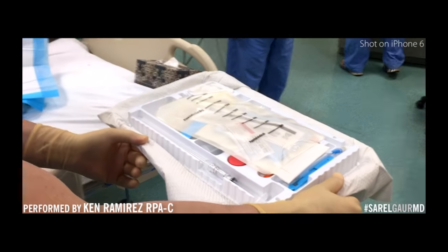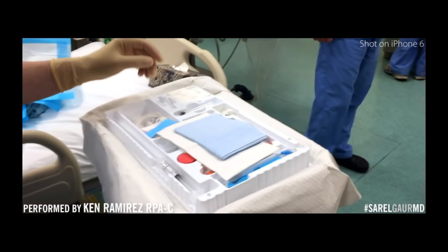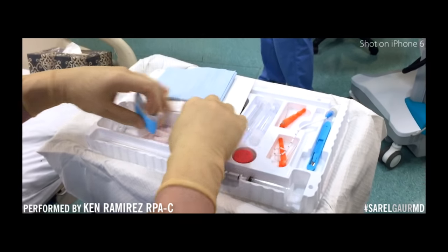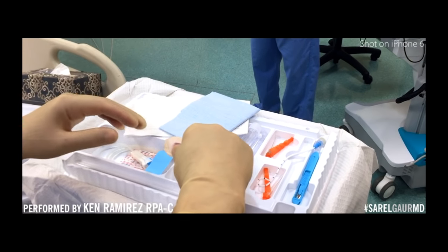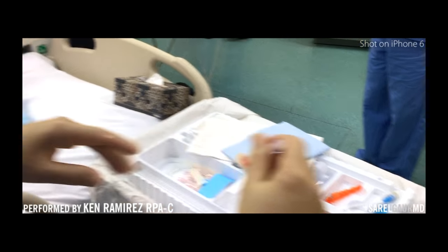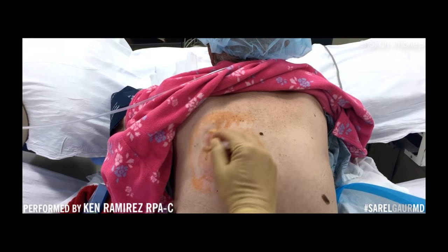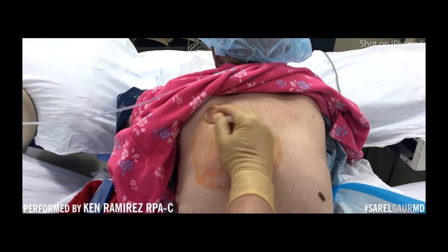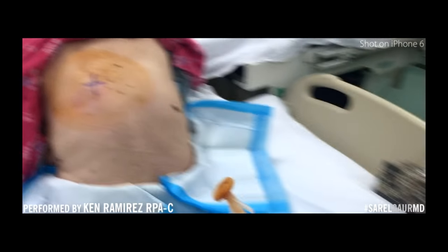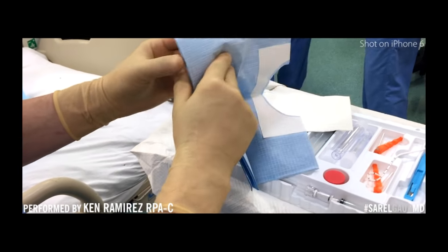We have what's called the Safe-T-Centesis kit. Parts of the kit that we don't need, we get rid of so that it doesn't get in our way. The Safe-T-Centesis kit uses a blunt needle and catheter to access. We have our ChloraPrep — we're going to prep the area and drape the area.